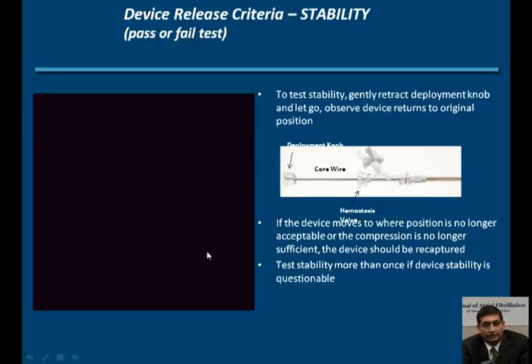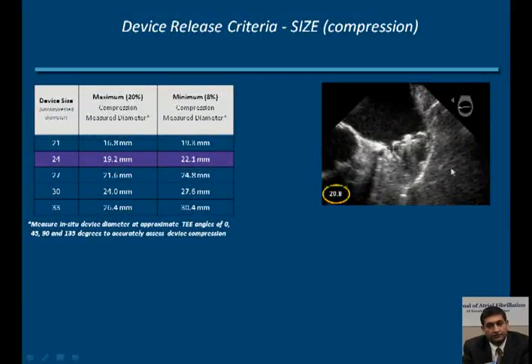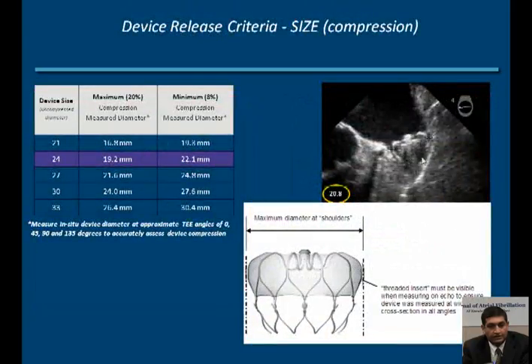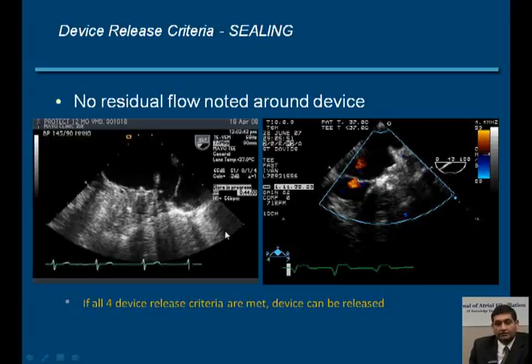PROTECT-AF also had this evolving experience, so improvements were made throughout the PROTECT-AF trial. There were better training, learning curve, and technical improvements. So when you look at the learning curve, the procedure times, as compared between the first, early, and late patients, came down considerably. The safety events were also much lower as the trial progressed. The implant successes went up, and the serious pericardial effusion within 7 days of implant came down rather dramatically.